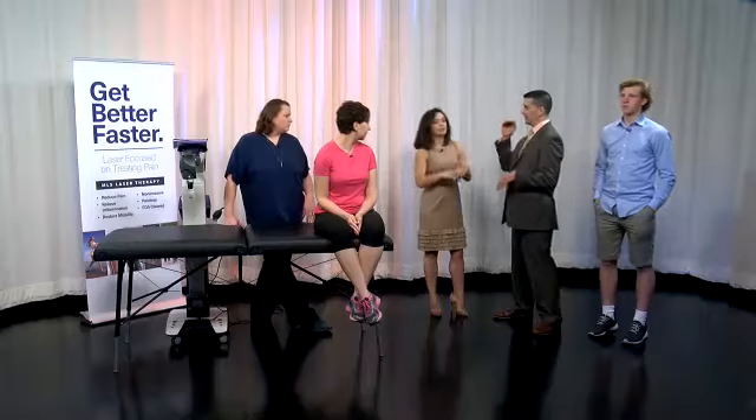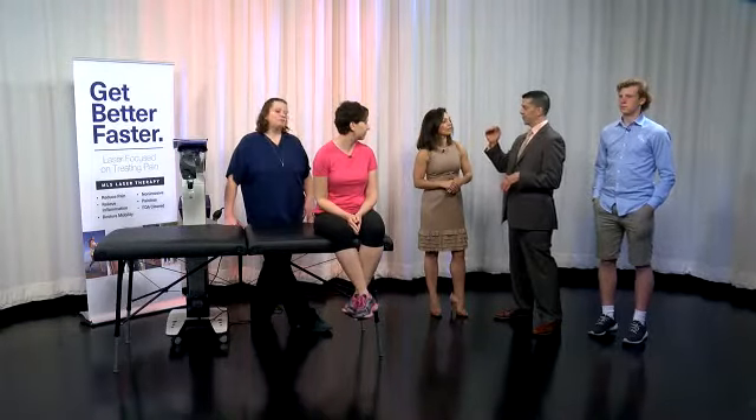Most lasers have one wavelength and it works, but this particular laser has two wavelengths. It's a patented system. There's a 905 nanometer wavelength that's more for pain control, and an 808 nanometer which is more for anti-inflammatory and healing. They both do both, but the 905 is better for pain and the 808 is better for treating inflammation. The protocols reflect that — if someone comes in with a lot of pain, we adjust so the 905 is more prominent.